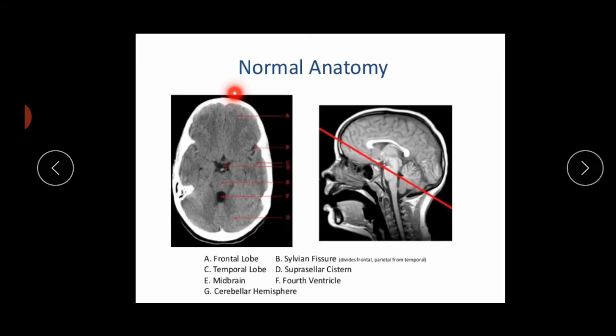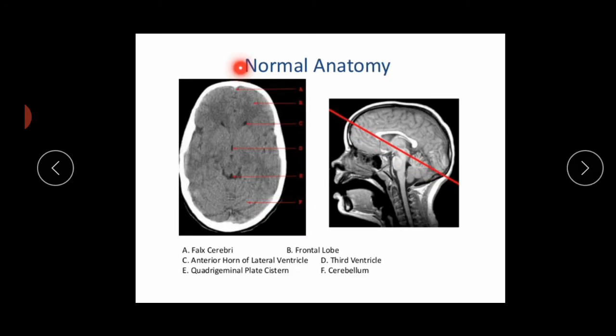On this level, we can see the frontal lobe and the Sylvian fissure. This is the temporal lobe. We can also see the suprasellar cistern, then the midbrain, the fourth ventricle, and the cerebellar hemisphere.